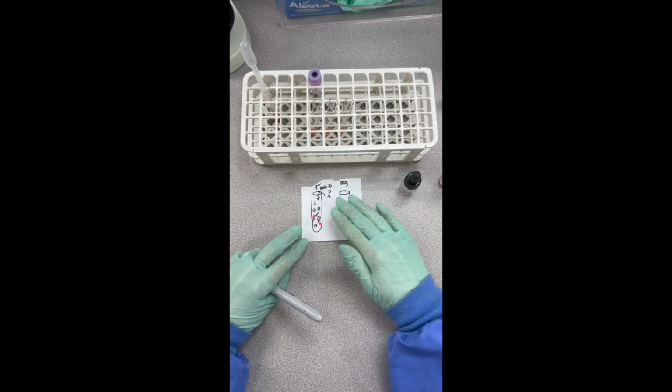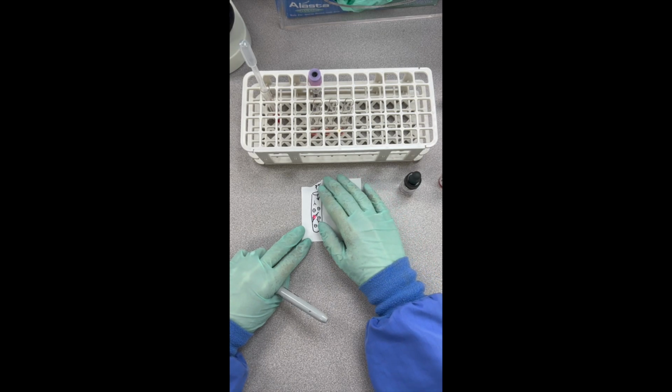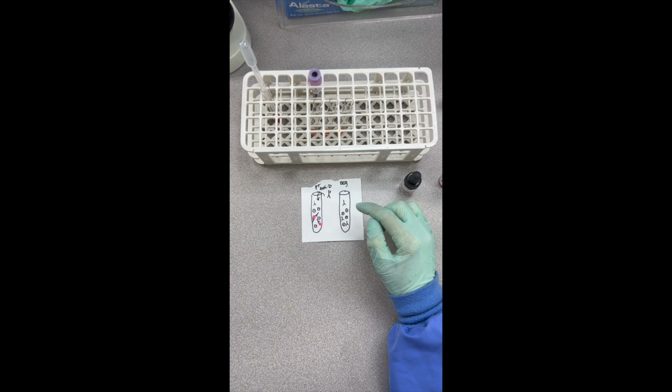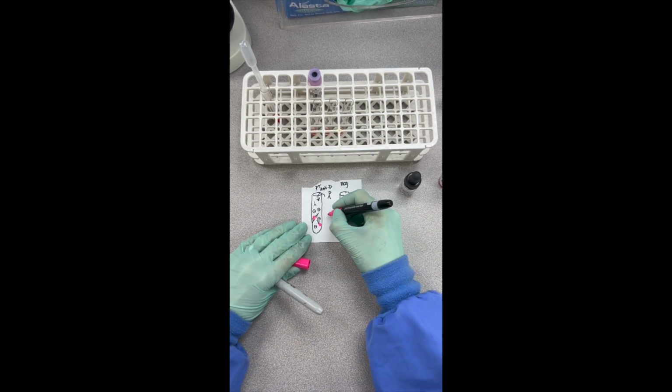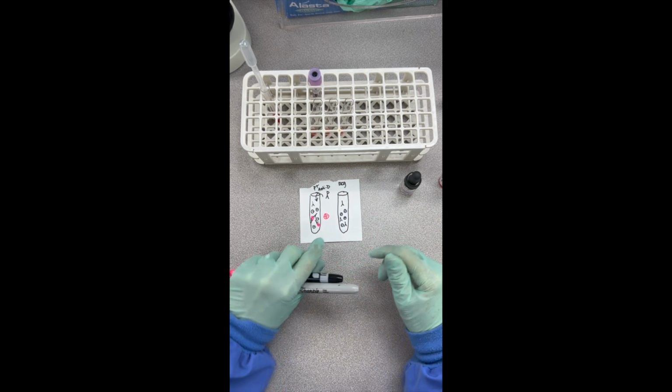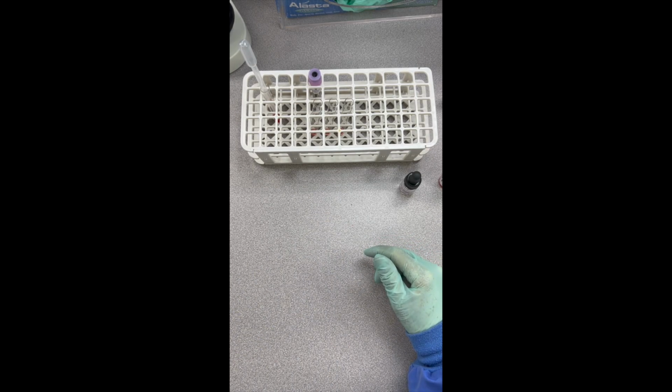And so during that 5-minute incubation, we're letting that antibody essentially sensitize these Rh positive cells that are in there. Here's a bigger picture so you can maybe see that plus sign. Okay? All right. So we'll be right back.